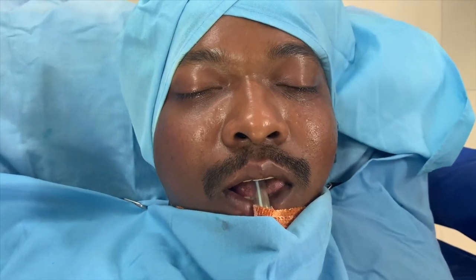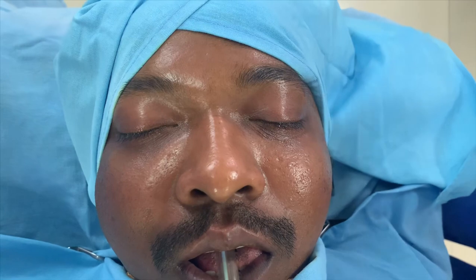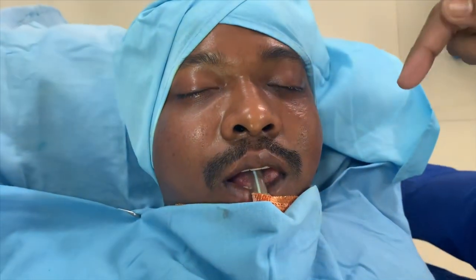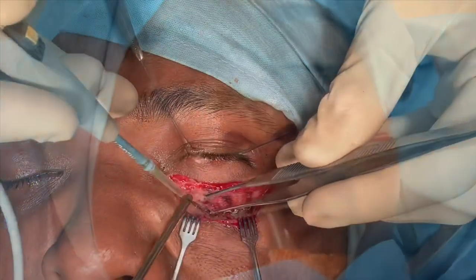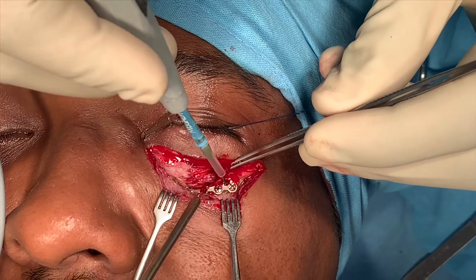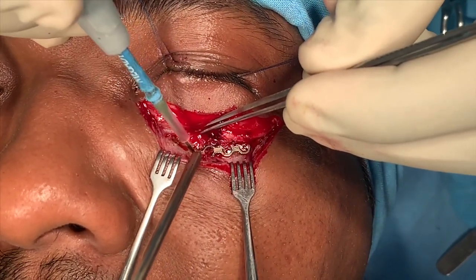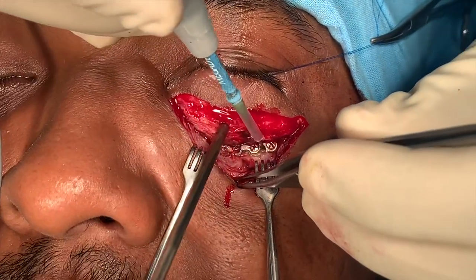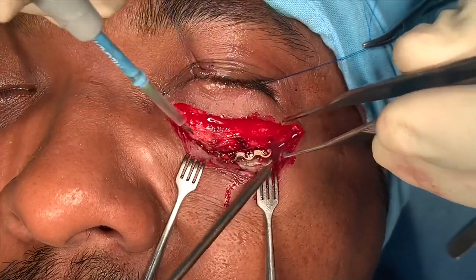You can see that there's not a huge visible difference on the patient — that's one reason why we use computer-assisted stereolithographic models and 3D printing of the plates. There's a scar here from the earlier surgeon's approach. I'm going to use the same scar and try to improve it in the process. I'll be using an infra-orbital approach because of that scar; otherwise the ideal approach would have been subconjunctival with a lateral extension. You can see that's the earlier implant we're reaching now — I'm going to remove it and then augment the orbit.